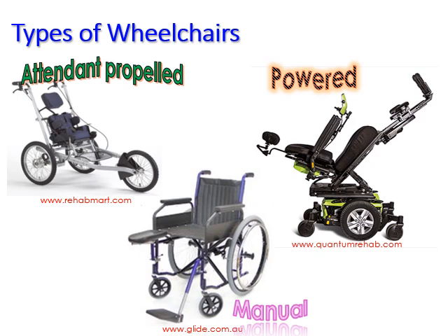On the right side of the slide, there are more examples. There's an example of a powered chair that can recline all the way back to relieve pressure. You have reclining power chairs for people who are unable to maintain an upright sitting position.